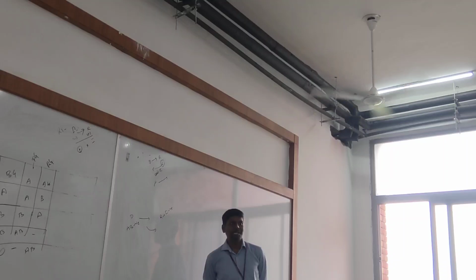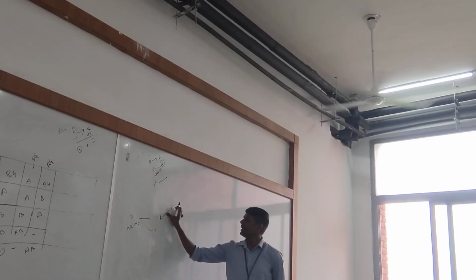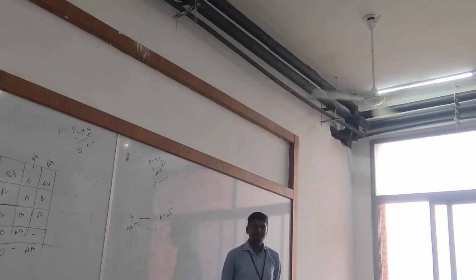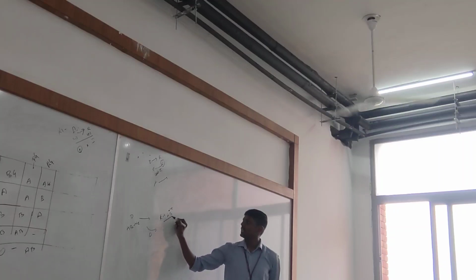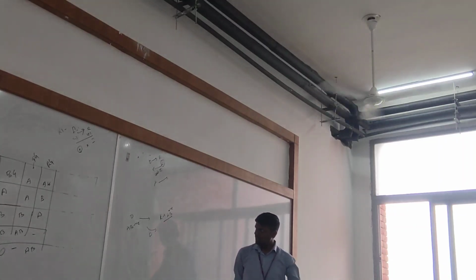Okay, I'm making some things here. Let me do one thing. My recipient is AB positive. Let me keep AB positive. Then he can receive all types of bloods, right? Universal recipient.